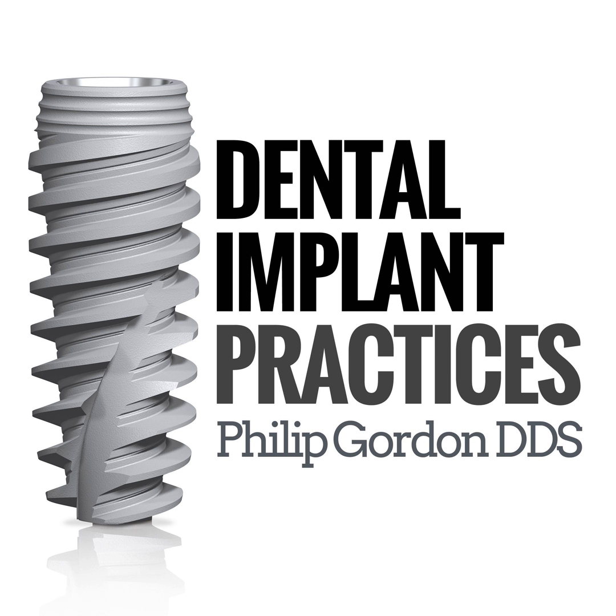Anyhow, the representatives, the salespeople for Branemark, were hesitant to sell the HA-coated implants. So then Dr. Schupak developed the TiUnite surface, which is basically hooking implants to electrodes and causing minuscule explosions on the surface to create something like porosity. But you can still do that with blasting, like we have on the Hahn implant, which is calcium phosphate blasted to the surface. And that has 30 years of clinical experience.